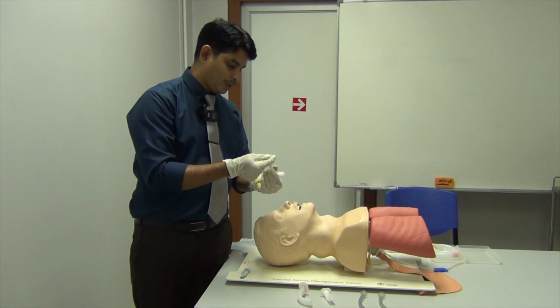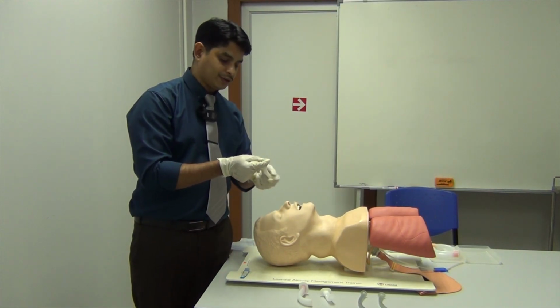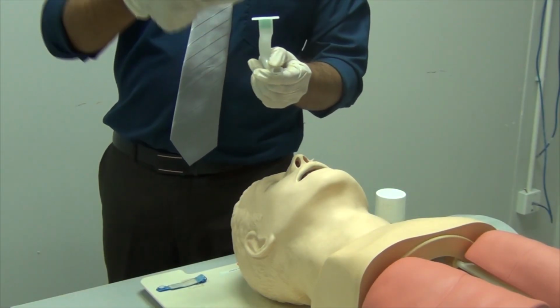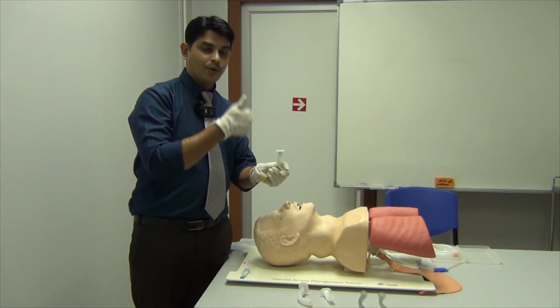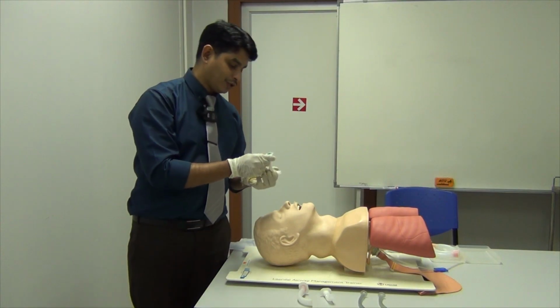This is the flange, which is placed over the mouth, over the incisors, and this is the tube. The tip of the tube, when ideally placed, should be just above the larynx. So this helps to overcome the obstruction and give oxygen continuously.